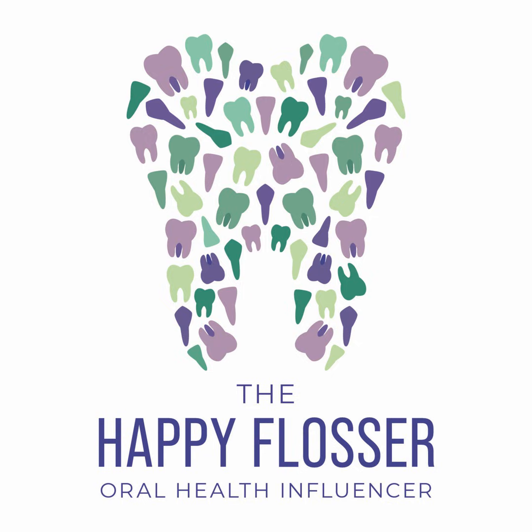The next thing you want to do, now everyone tackles this just a little bit differently, and I'll tell you what the textbook tells you. The textbook tells you to start in quadrant 1 and then scan the whole mouth. It doesn't matter if that's what you do or not. What really matters is that you're checking everything.